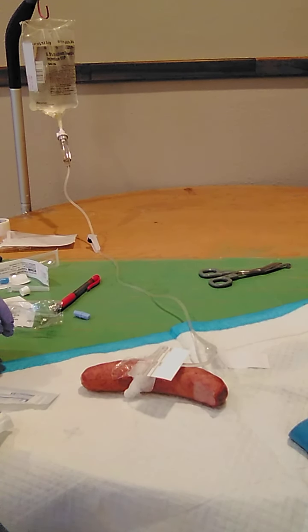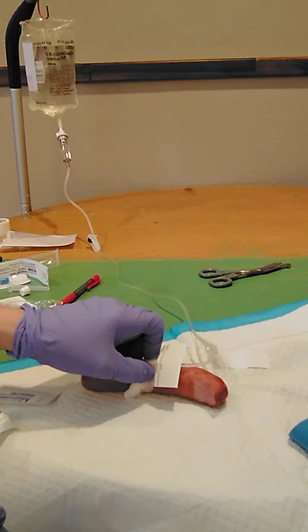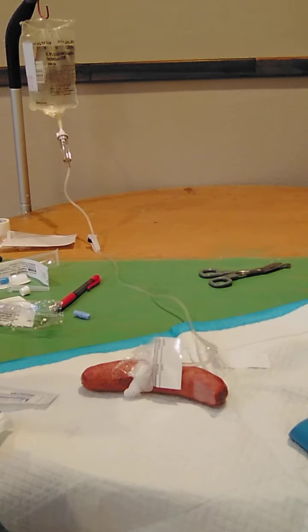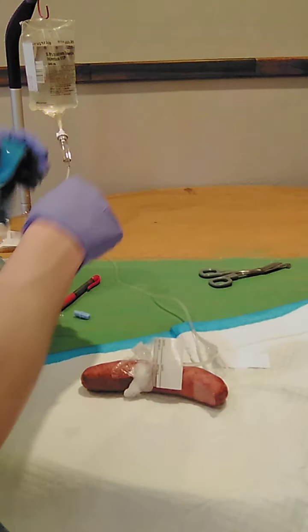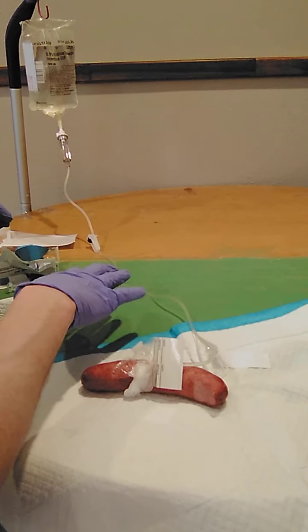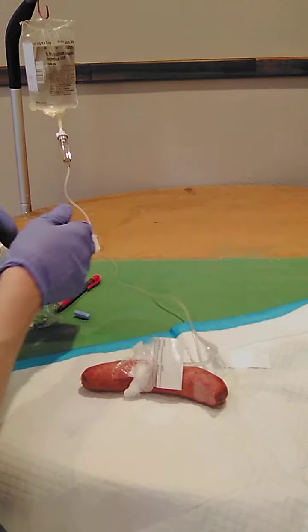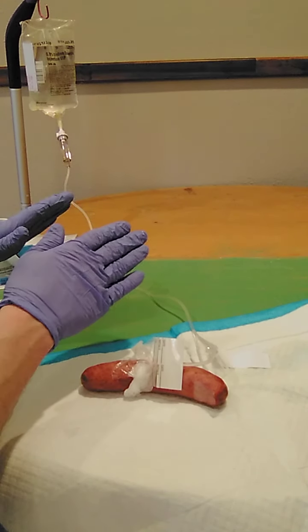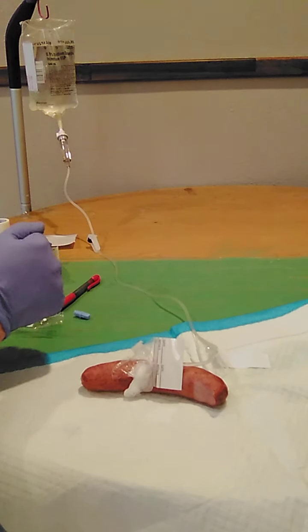I'm going to be mindful of when to anticipate this infusion ending, either if it's volume dependent or time dependent as specified in the medication administration record and the order from the provider. And now I'm going to dispose of these supplies in their appropriate place, as well as lower the bed to the safest position and make sure the call switch is within reach of the patient. And that concludes my peripheral intravenous infusion, initiating an IV for this class. Thank you.